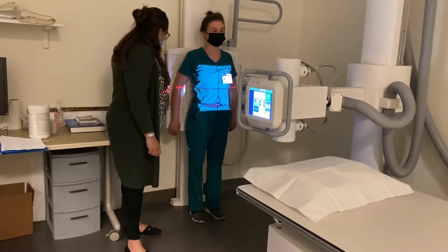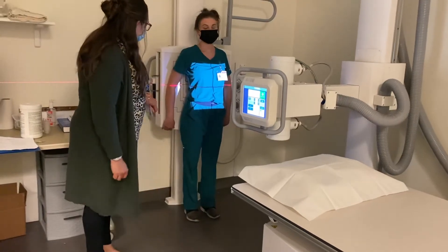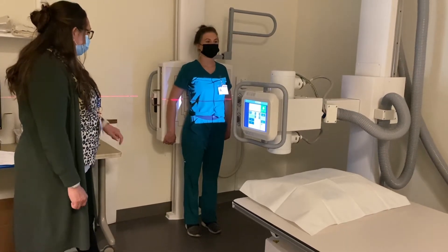This board's going to move behind you. I want to make sure the arms are out away from the body and make sure that I'm centered to the mid-sagittal plane. Then I'm going to have my patient take in a nice deep breath, blow it all the way out and hold it out.